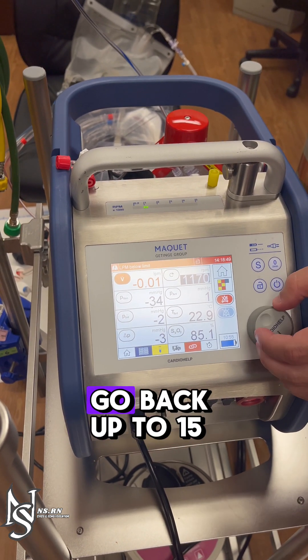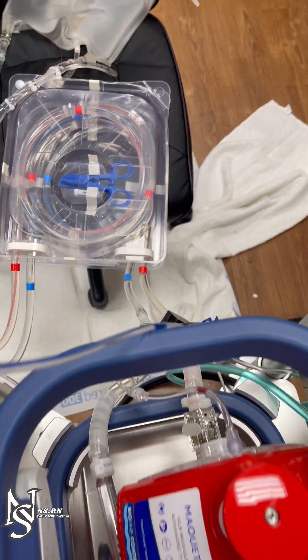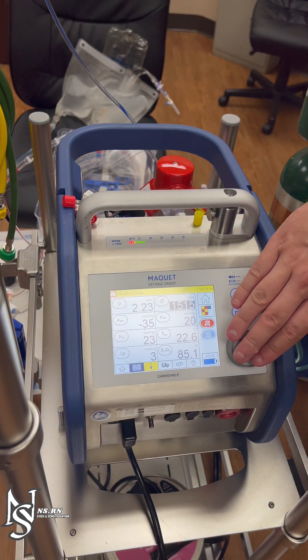After air is removed, go back up to 1500 RPMs and unclamp. Then gradually return to previous flows.